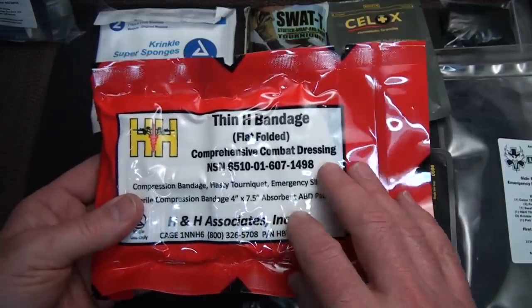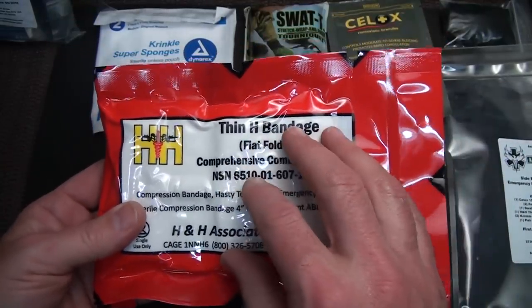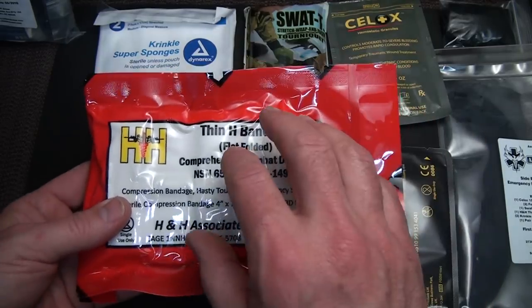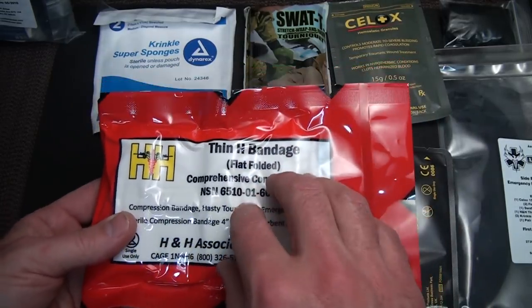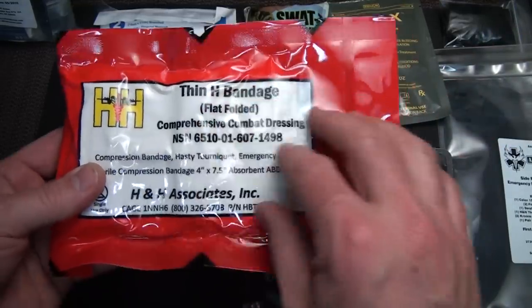But the big thing this does is you stuff this into the wound canal. You get that bleeding stopped. Use the Celox to get the bleeding clotted, and then you come along with the H&H bandage, and you just take that compression, and you just put it into the wound.